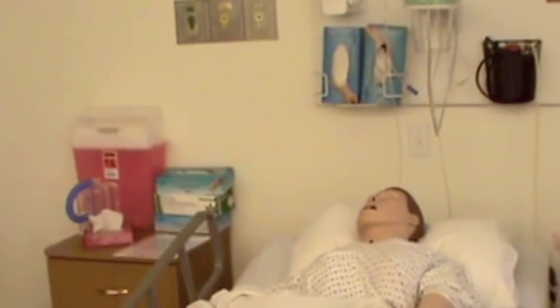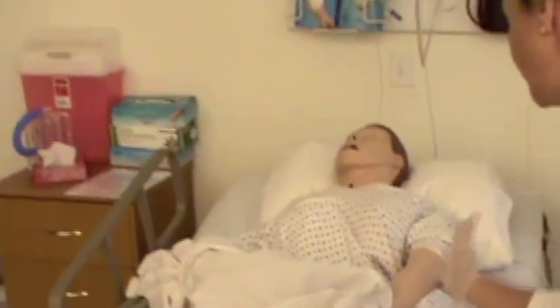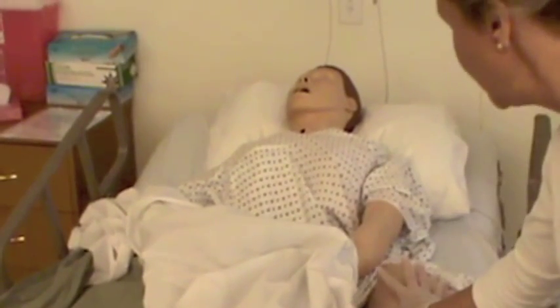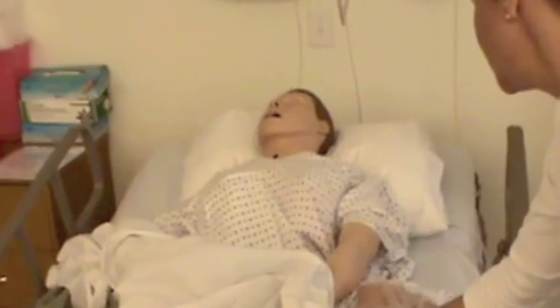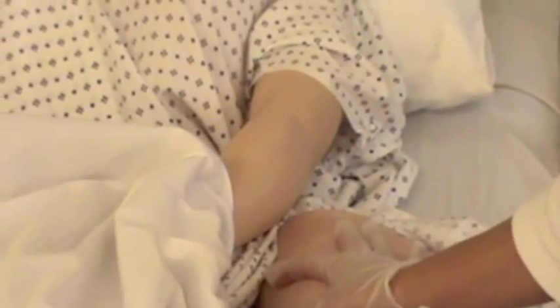Ito. So what I'm looking for is I'm pointing my thumb to the groin. I'm placing my palm on the greater trochanter, thumb to the groin, and then I am taking my pointer finger and putting it on the anterior superior iliac spine, and my middle finger is pointing towards the iliac crest.